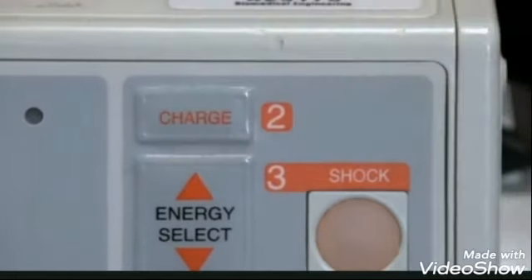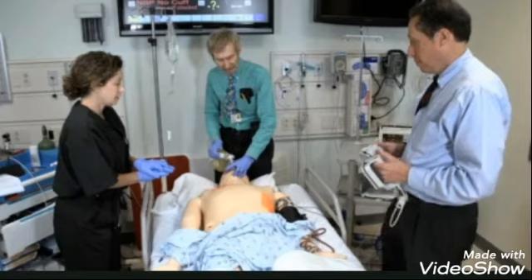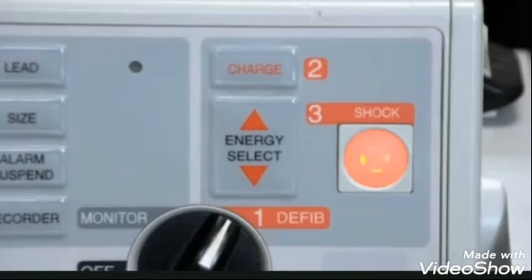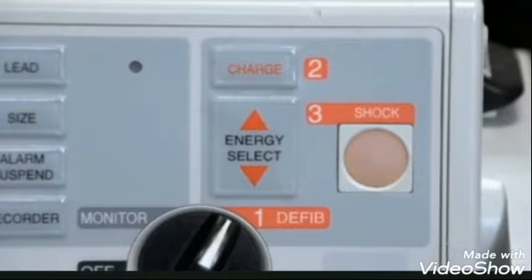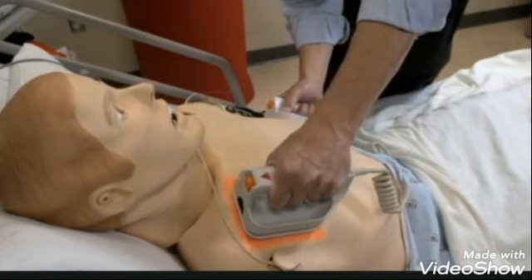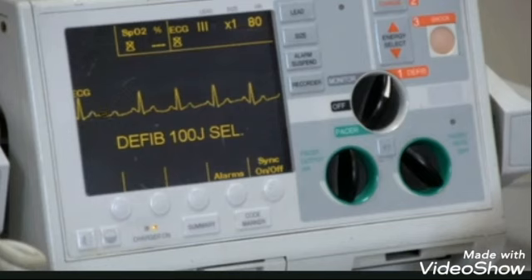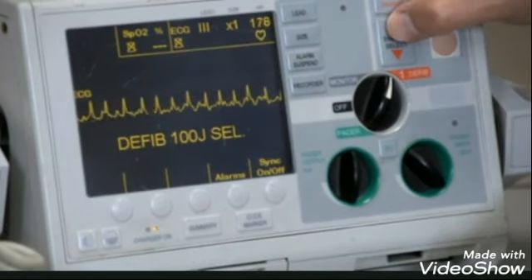Press the charge button. When the machine is charged, ensure that everyone is clear and no one is touching the patient. If you are using pads, deliver the shock by pressing the button on the machine. If you are using paddles, put them on the chest and push the buttons at the same time. Check the monitor to see that the patient is back to sinus rhythm. If not, an additional shock may be given: 200 for biphasic, 360 for monophasic.